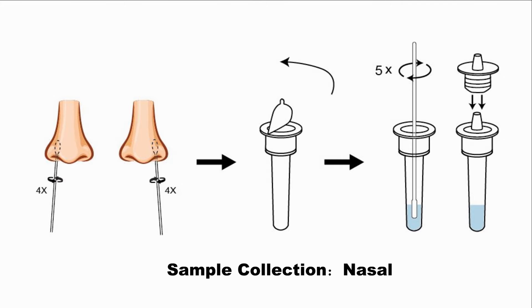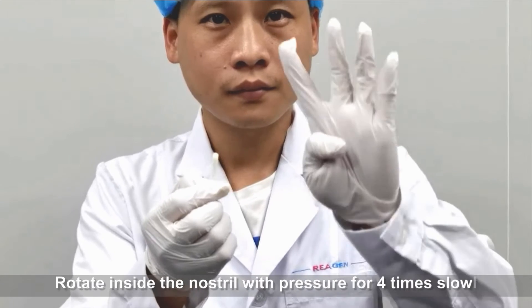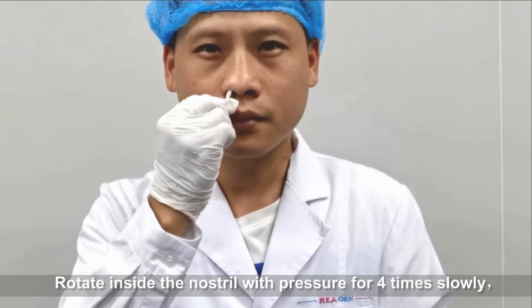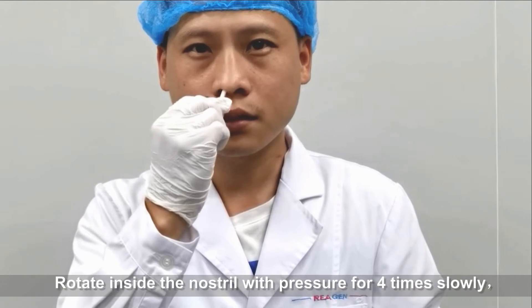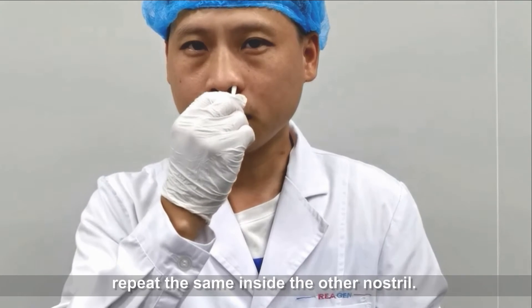Nasal: Rotate inside the nostril with pressure for 4 times slowly. Repeat the same inside the other nostril.